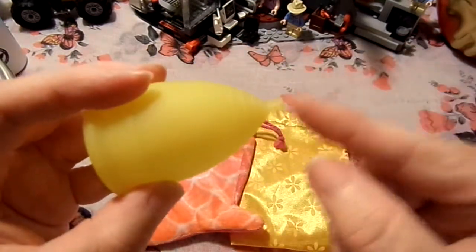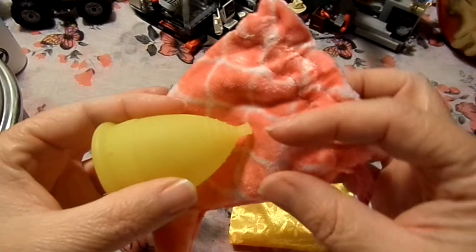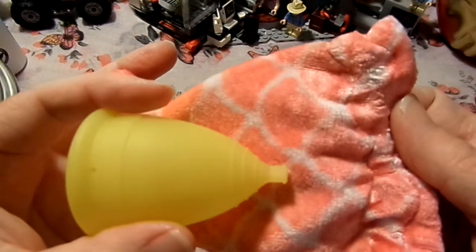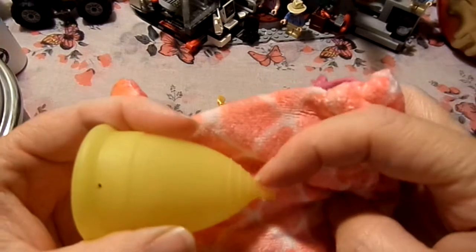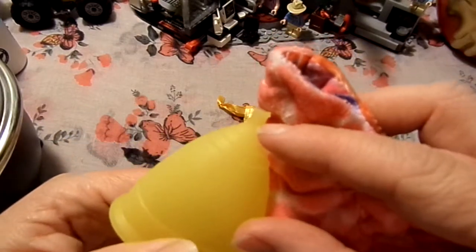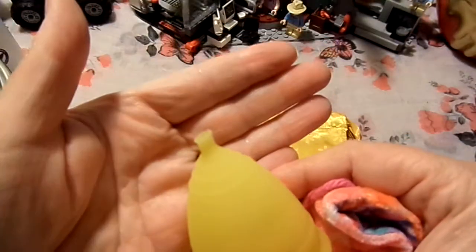And I have cut off the stem. The stem was probably about this long, and it would actually poke out the bottom of my labia, and it would hit my underwear, and that led to a very uncomfortable experience. So I did cut this down. As you can see, there still is a little bit left. I know some people cut it right down to the base itself. I didn't particularly feel the need to do that.